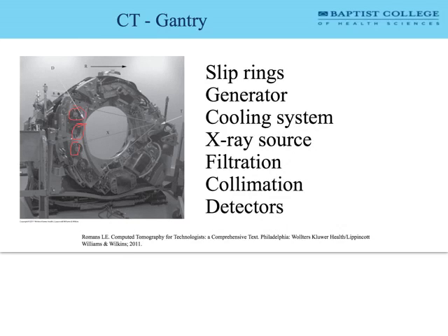Okay, so if you look at the bottom of page 117, just go ahead and X out xenon gas. We don't do anything with xenon gas anymore. Don't even read it. It doesn't matter. I mean, it's helpful to have a historical perspective on it, but I'm not going to test you on anything related to xenon gas. Everything's solid state crystal now.